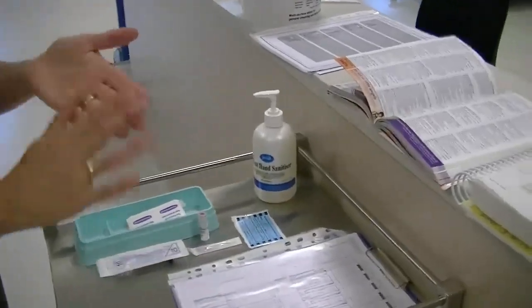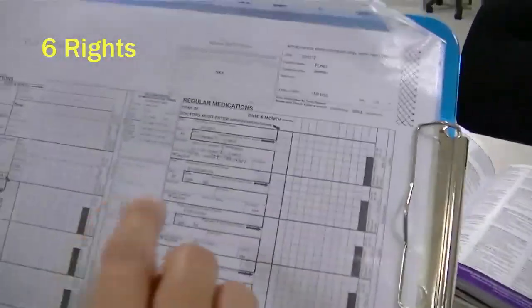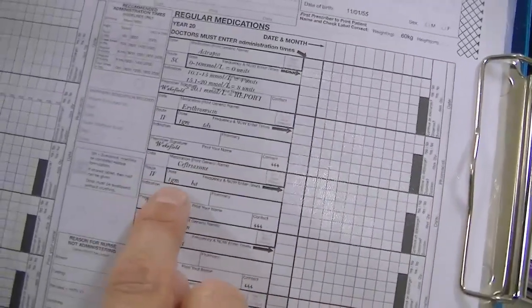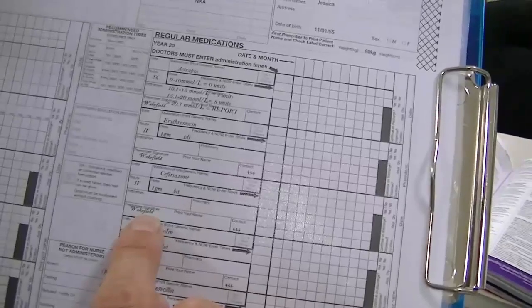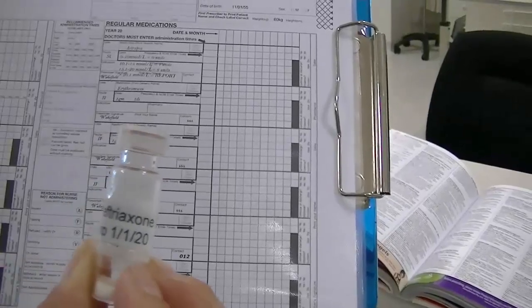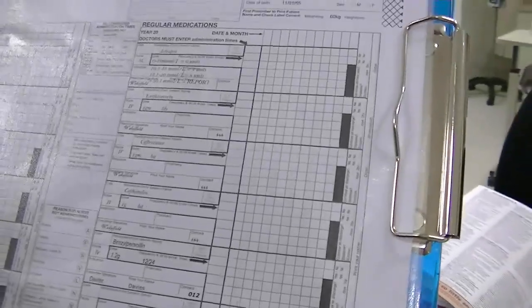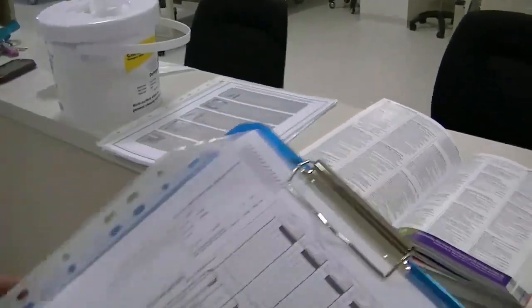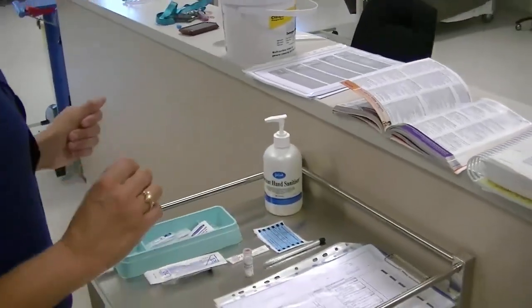Nurse, can you please check this with me, please? Sure. I have to administer ceftriaxone for Jessica Fong, IV, 1 gram, it's twice a day, the doctor signed it. I have ceftriaxone, 1 gram, it expires in 2020. I've just noticed that the doctor hasn't put a date on that. Can we just rectify that before we administer? Sure, we'll do that. No worries. Water for injection 10 ml, January 2015. Okay, I'll get that fixed.